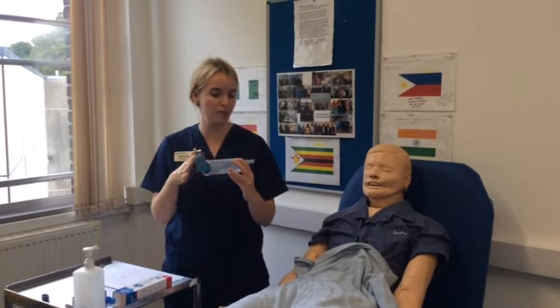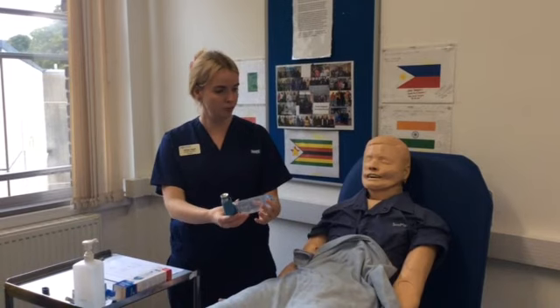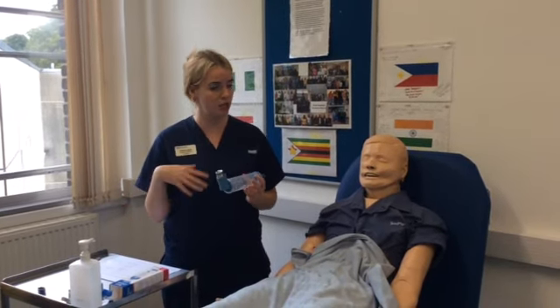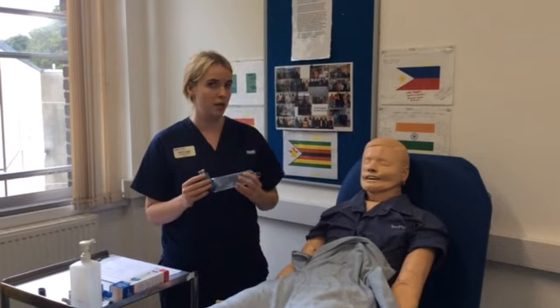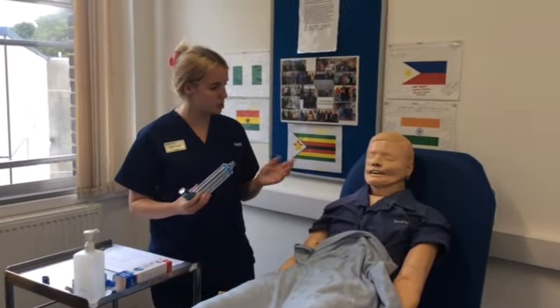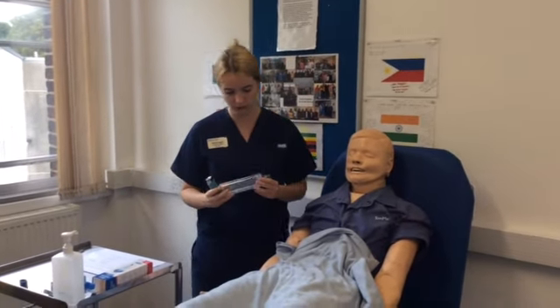Breathe normally for about 5 seconds, then remove this and breathe out. Then you can have a little break of about 30 seconds, and then we need to repeat it again because you're having 200 micrograms and that's 2 doses. Is that okay? Yes, that's fine. Okay. Are you happy for me to proceed, or I'll help you take this? No, I'm happy to go ahead now, I understand.